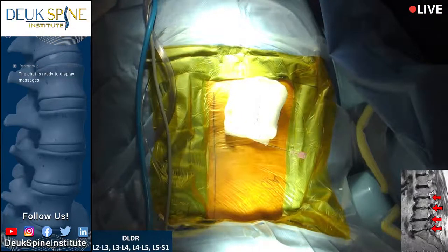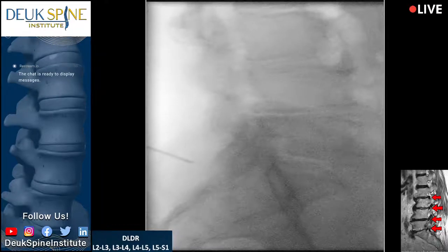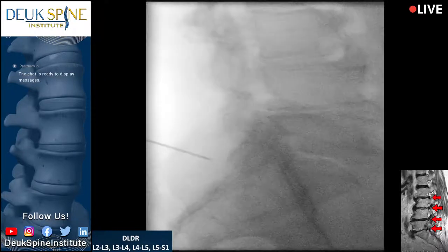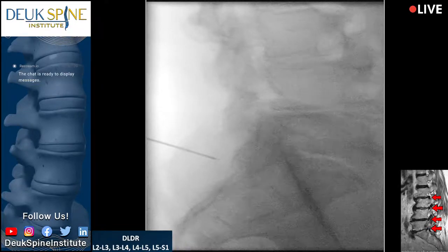All right. You see those facet joints at L5? They're a little bit off by about a degree and a half. That's maybe not a wag, but an orbital issue. And I think he's moved away from you. That's why. Let's see. Shot. My job here in the operating room is not just to operate. Your orbit's off. It's worse. My job is not just to operate, but I have to play a kind of human herder. I've got to herd and get his body where I want it to be so that we can get an accurate representation. Let's try a little further, see what happens.